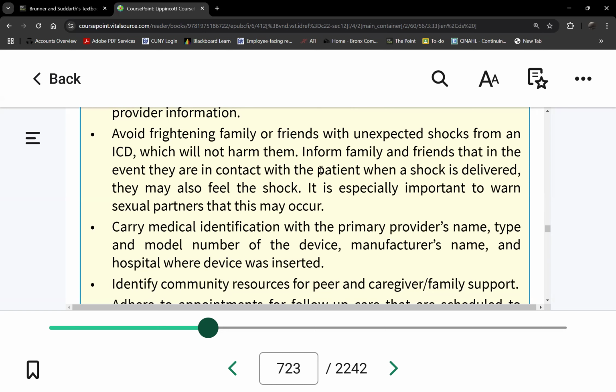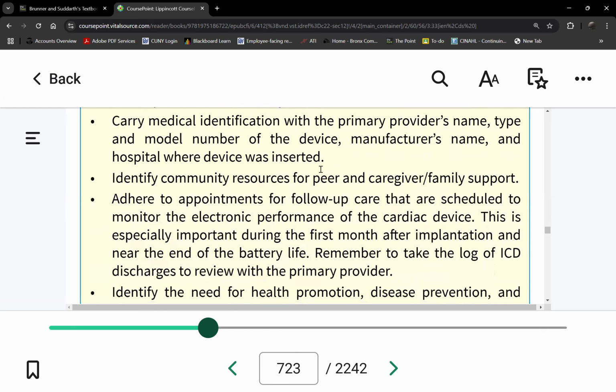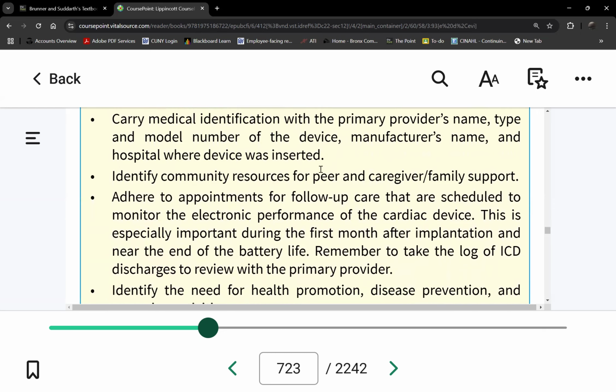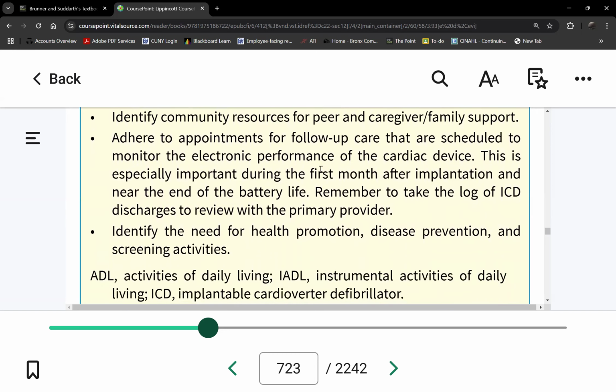Just reassure them. Yes, it may fire during sexual activity, but reassure them, this is not 110 volts. This is a small battery, so it can only generate small electrical shocks. The partner may say, oh, I'll never be intimate with you again because you might electrocute me. So reassure them it's not that much. It's not that bad.